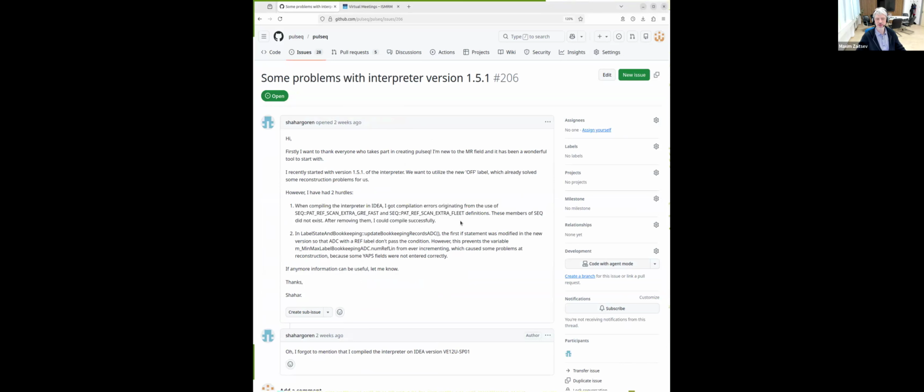The problem is that, because of the diversity of the Siemens systems in the field, we have no overview of at which time point these flags were introduced, so we cannot really detect the situation for now.